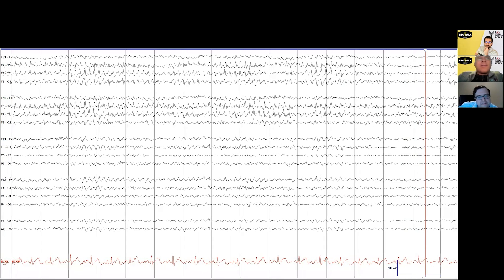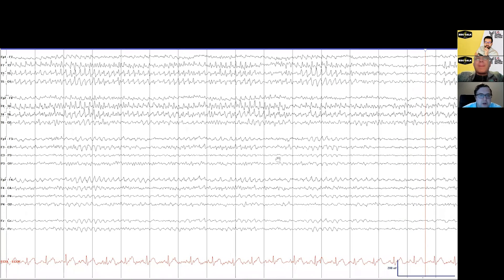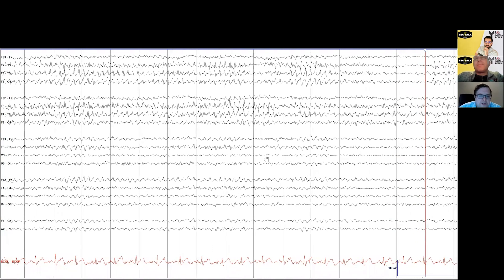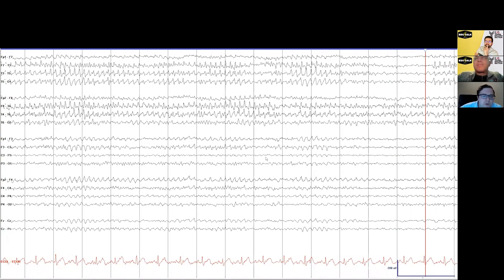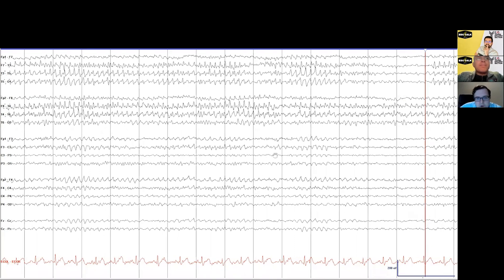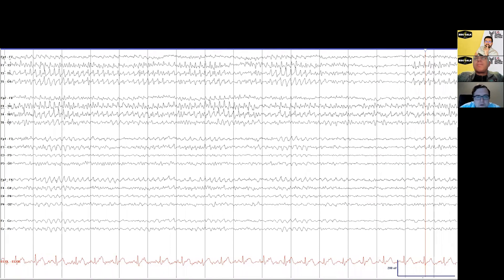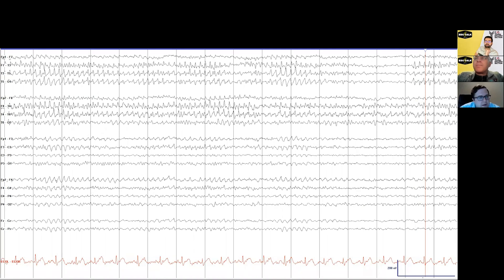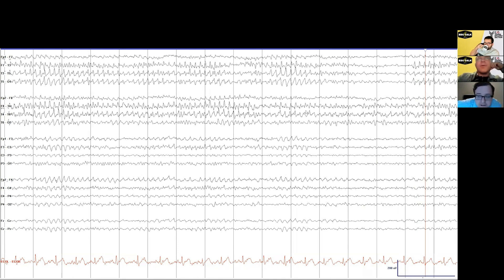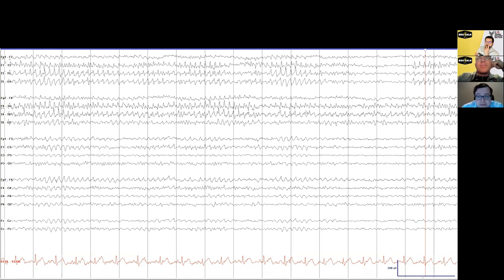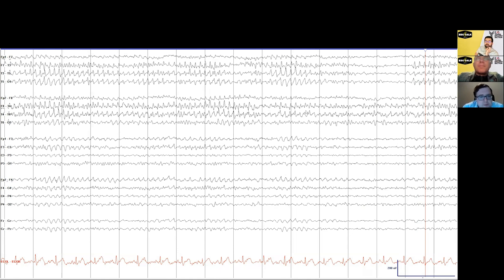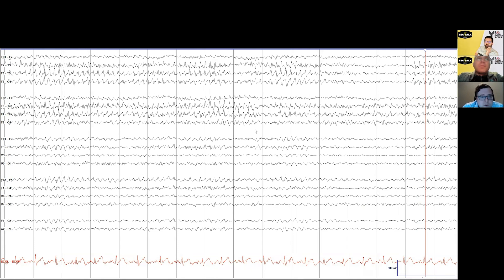Because it can look similar to temporal seizures or psychomotor seizures of yesteryear, but it doesn't really evolve like a seizure should. So the theta frequency stays pretty consistent throughout. Usually it goes on for a couple seconds up to 15 seconds on average. This one might be a little bit on the longer side. But what does the patient typically do during one of these if you're to talk to them or wake them up? Yeah, they should be doing nothing. They should be fine. In this case they're just sitting around being drowsy. So the concern would be getting confused for an electrographic seizure like you're talking about before, and it's just one of those normal variants to be on the lookout for to not confuse for an epileptiform abnormality, because you don't want to over-call this and commit this person to seizure medications for the indefinite future.